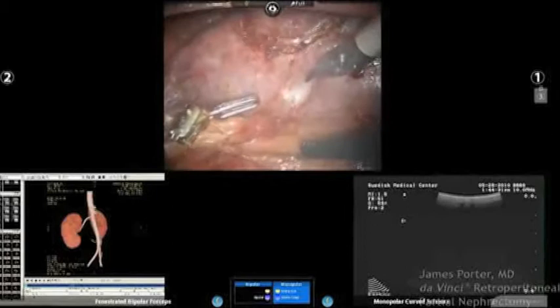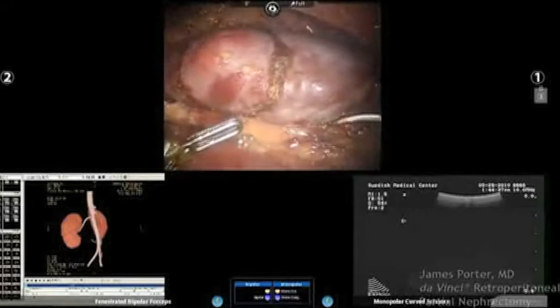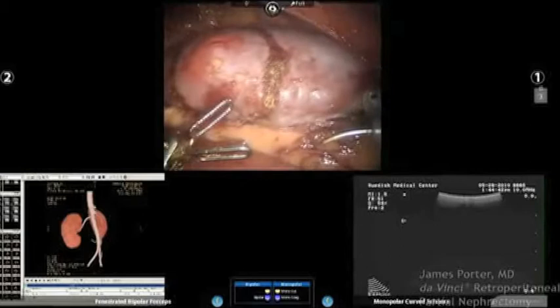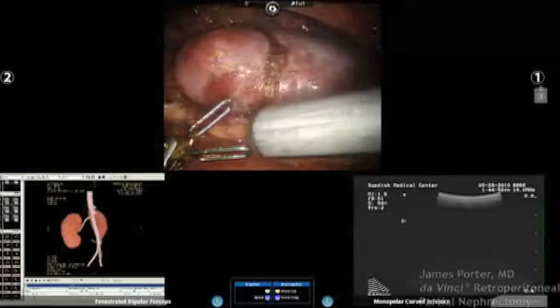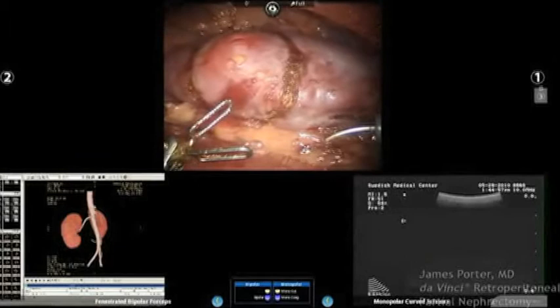I probably couldn't even quote it back to you how to measure that. But I do tell you that we base it on just hints of what you see on the CT scan, and you go into the case with an idea of what you want to make happen. And ultimately, going in there and dissecting it out and seeing if it nucleates out. If it's something that you were thinking you're going to do a radical nephrectomy on, the patient's consented regarding that. And if it's someone who needs a partial nephrectomy, they know that they might get an open if you think you can't accomplish it laparoscopically, because obviously renal preservation is the most important thing, not an incision.